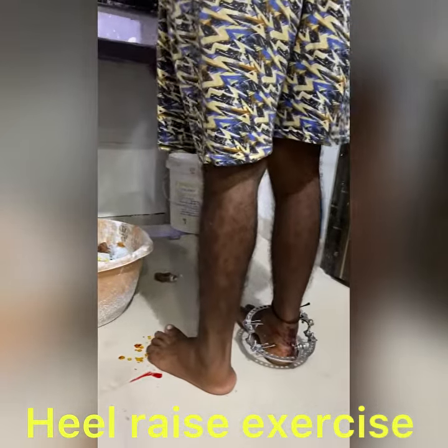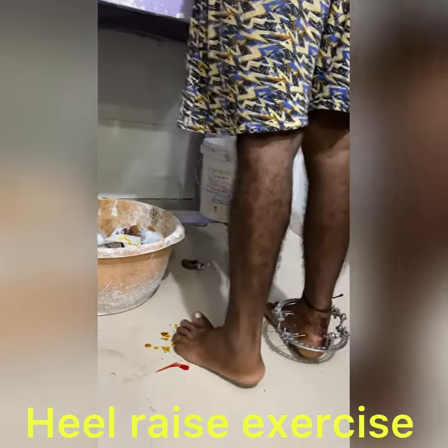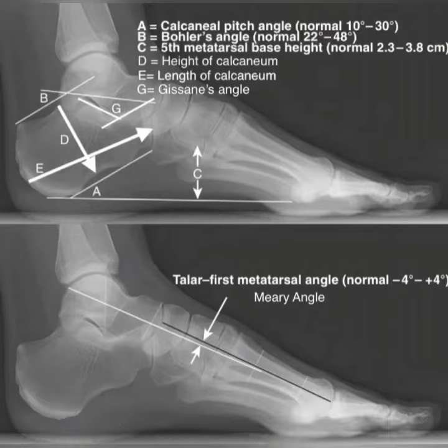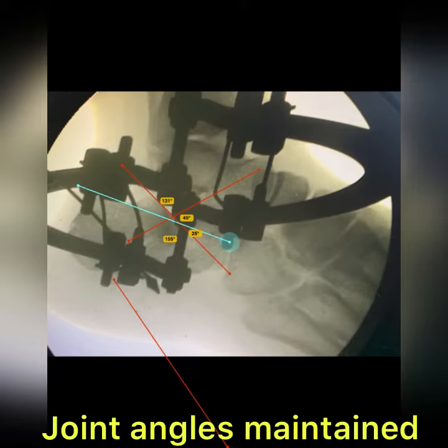The patient is doing heel raise exercises for muscle activity and balance, so there is no orthosis required. You can see all the joint angles are normal. These are the outcomes maintained post-operatively. Thank you.